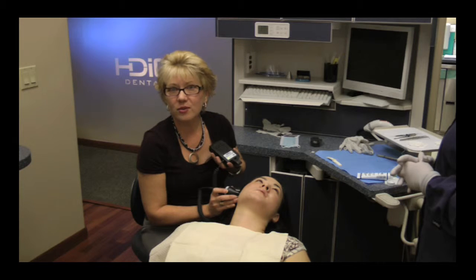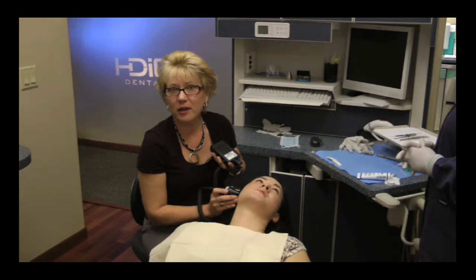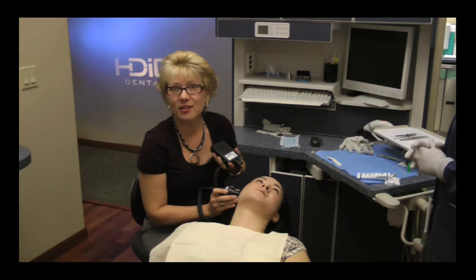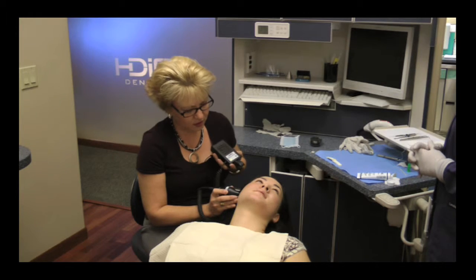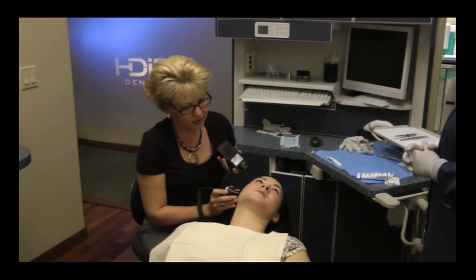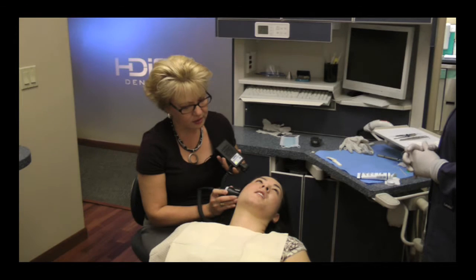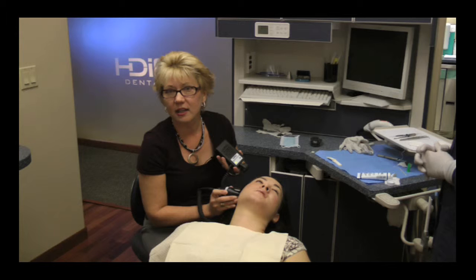So the first thing I want to do is listen to rotation. So I'm going to simply ask Katie to only open about a 1/4 inch, and when she closes, not to actually touch her teeth together, because you can often think that's a pop or a click when you hear the clack of the teeth coming into contact. So you ready, Katie? All right. So just about a 1/4 inch, and close without touching, and open, and close, and open, and close. All right, and so Katie's joint is totally normal in rotation.